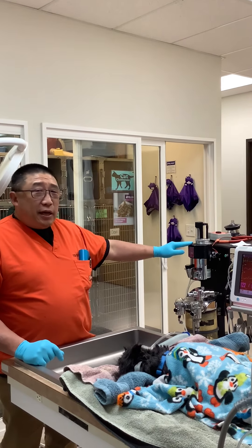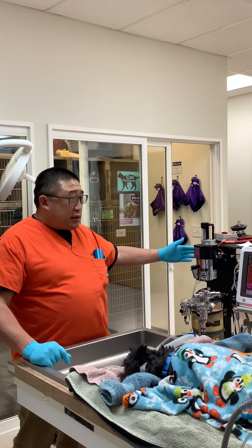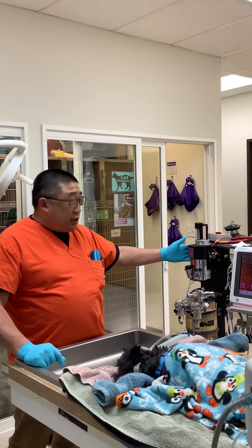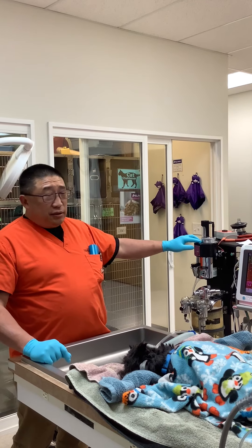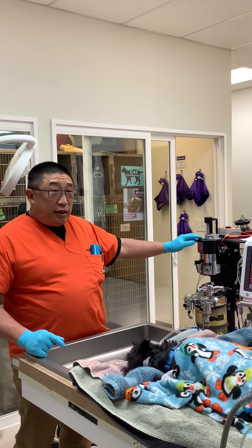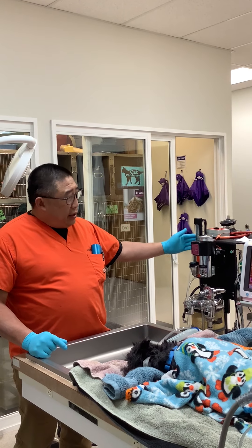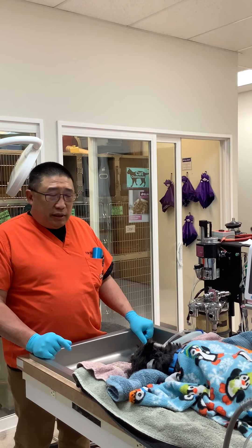This is the anesthetic machine, and it's not so much for monitoring — this is how we administer the gas. This is the precision vaporizer; this is how we deliver the gas. Right now, only one percent of what this dog is receiving is anesthetic gas. The rest of it is oxygen, so mainly they're receiving oxygen with a tiny bit of gas just to help keep them asleep.